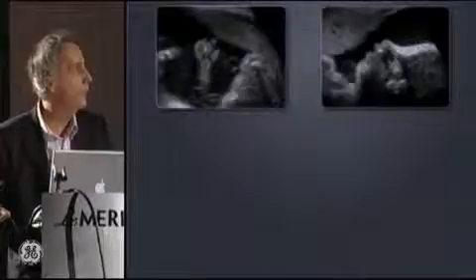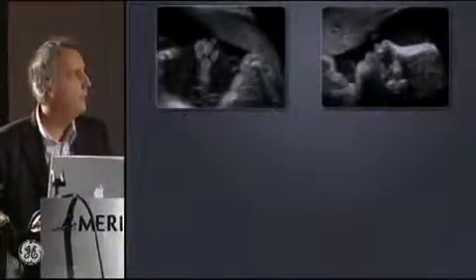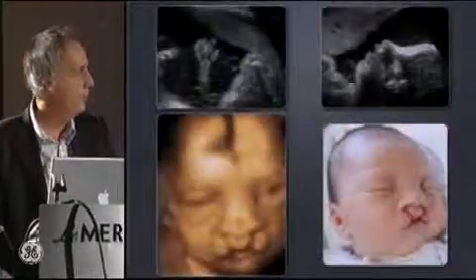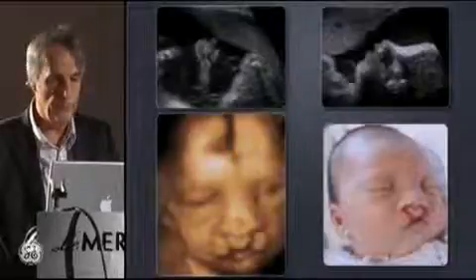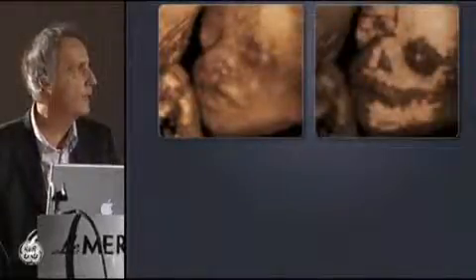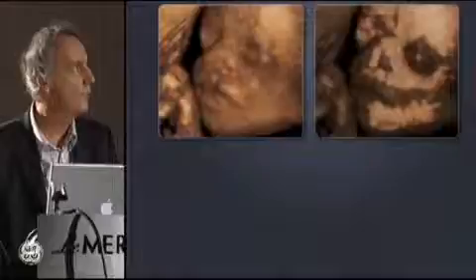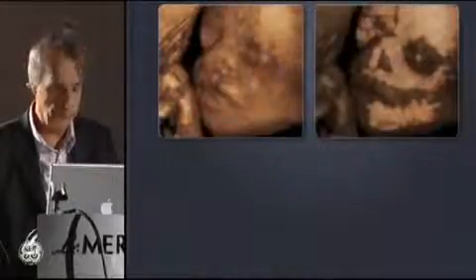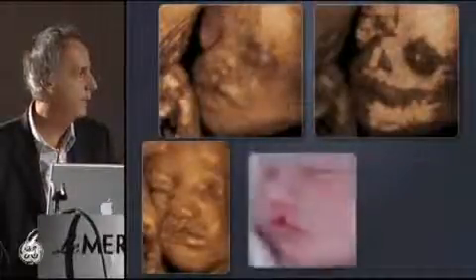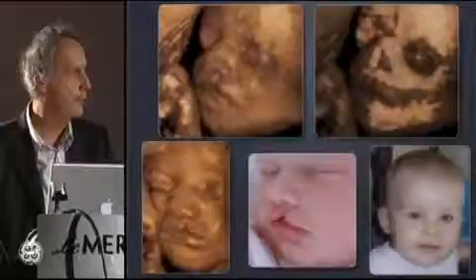Some examples, a bilateral cleft lip here, and also a cleft in the palate. It was easy on the 2D picture, but it's not so easy. The baby in 3D and after birth. Another case, a cleft lip here. And using the maximum mode, you can see you have no cleft in the alveolar ridge. That means there is no reason to have a cleft in the posterior palate in this case. And this was the same at 32 weeks, at birth, and after surgery.